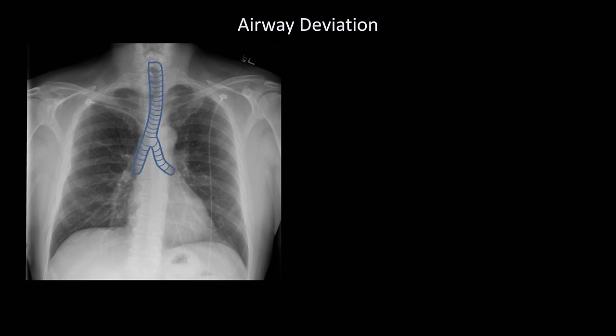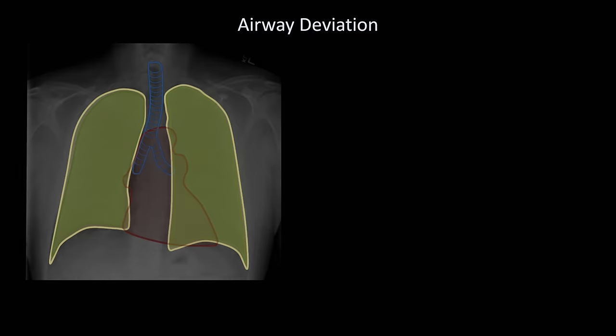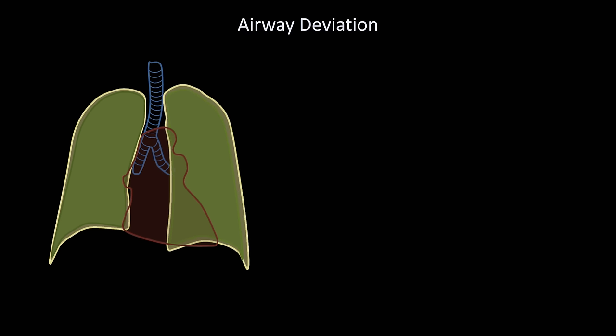We'll start off with a normal chest x-ray and superimpose an outline of the airways, the heart, the lungs, and around the lungs, the pleura. What happens when air is introduced into the pleural space, a condition known as a pneumothorax? Since the intrapleural pressure is usually lower than atmospheric pressure, more and more air will begin to accumulate, and as it does so, the lung on that side becomes compressed.